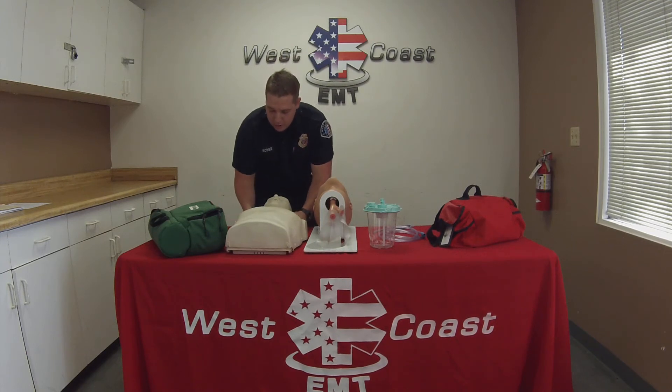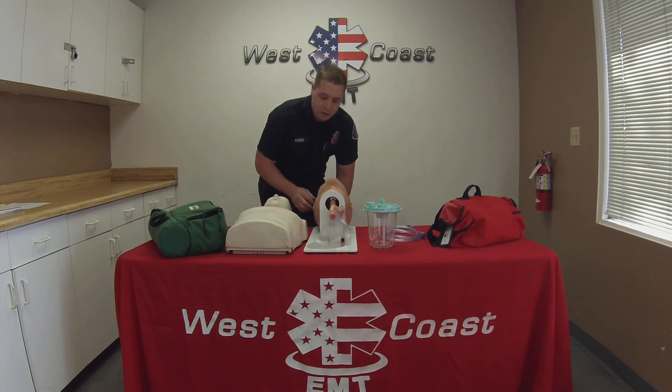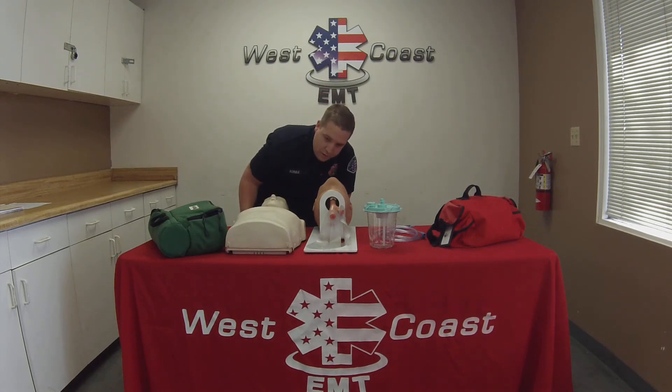Sir, sir, can you hear me? Go ahead and apply a trap squeeze. Patient is unresponsive. I'm going to go ahead and check to see if the patient's breathing. The patient is unresponsive and apneic.